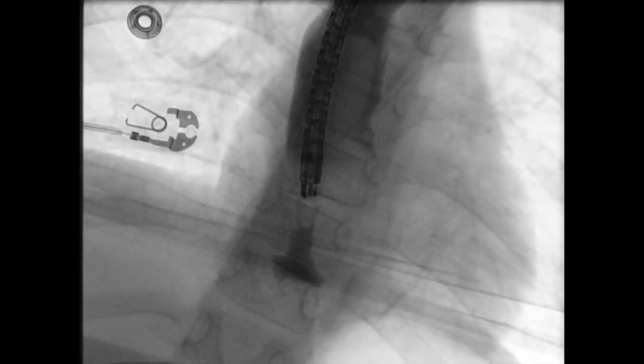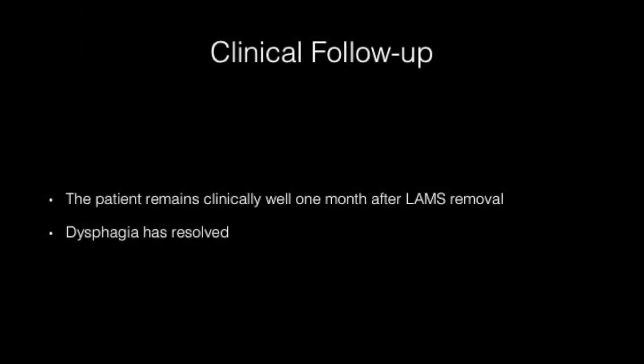Prior to endoscope withdrawal, contrast was injected through the tract. The only remaining cavity was that left behind from the previously placed lumen-opposing metal stent. The patient remains clinically well one month after stent removal. Additionally, his dysphagia has completely resolved.